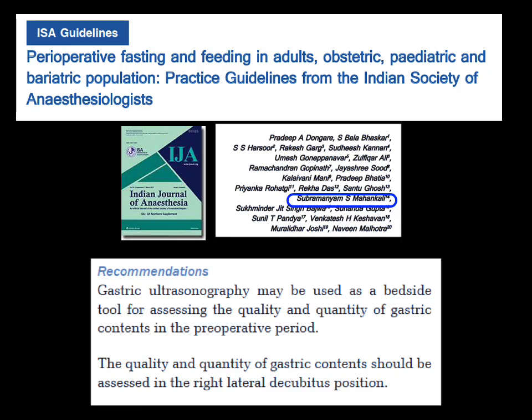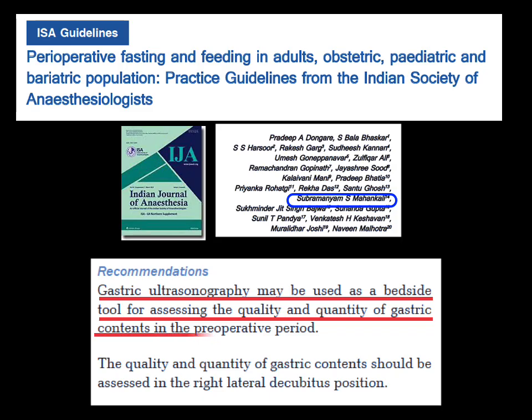Now, around 5 years back, our ISA came out with a guideline on the role of gastric ultrasonography in assessing patients. It says that you can use it to see the stomach and assess what is there in the stomach.